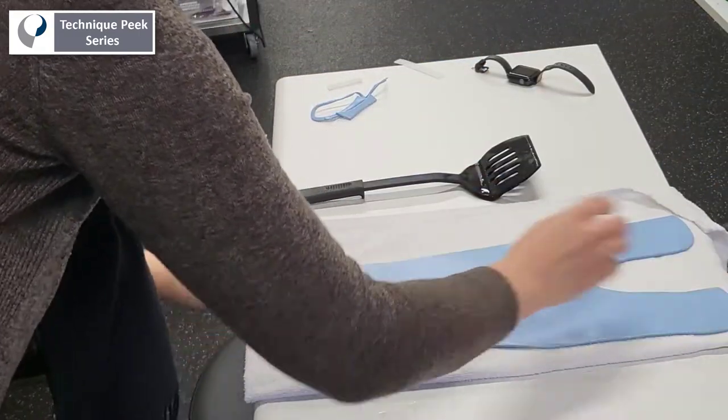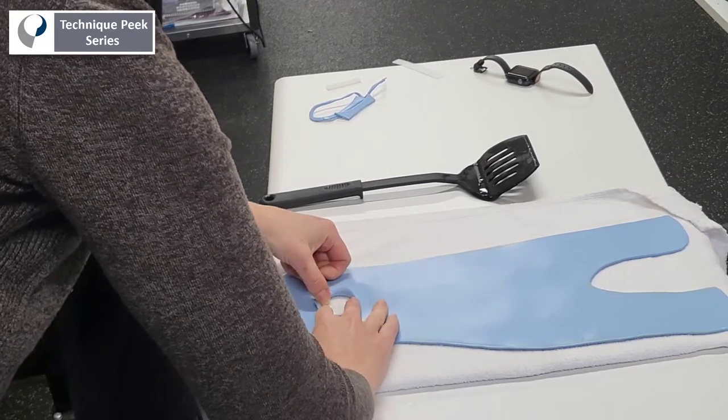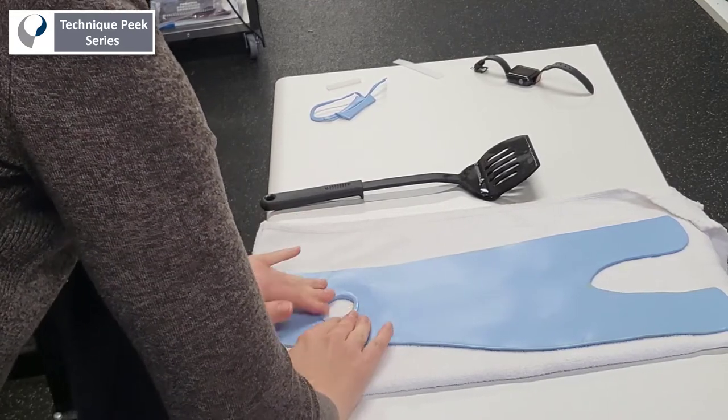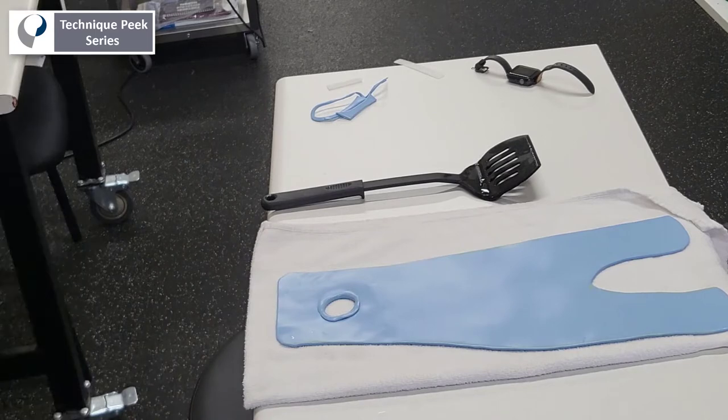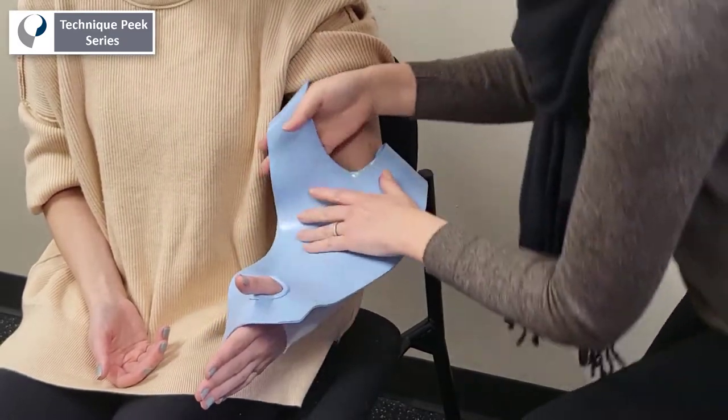With the patient positioned in elbow flexion and forearm and wrist in neutral, gravity will help you control the material during the molding process. Once you drape the material onto the patient, start distally and stretch the material gently to enlarge the thumb hole and clear the thenar eminence.